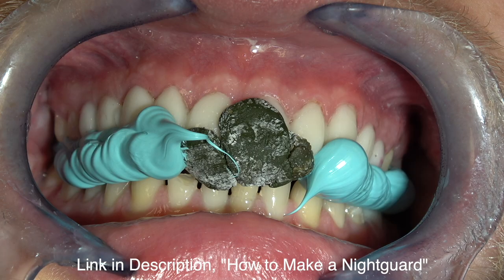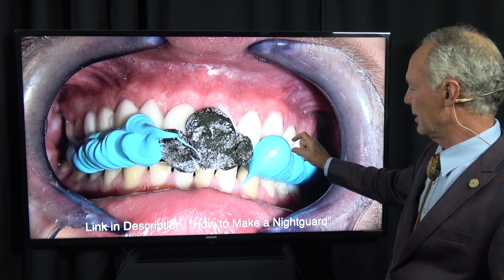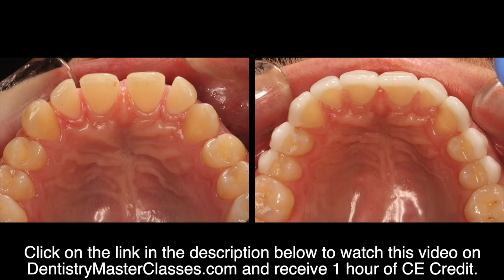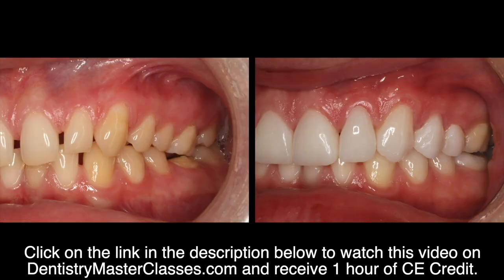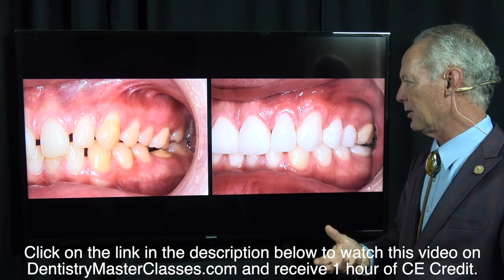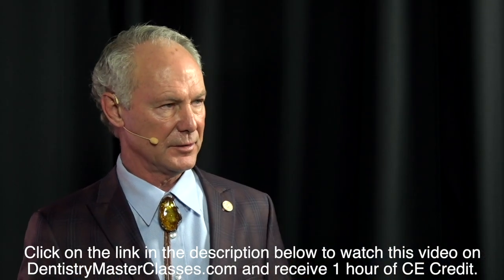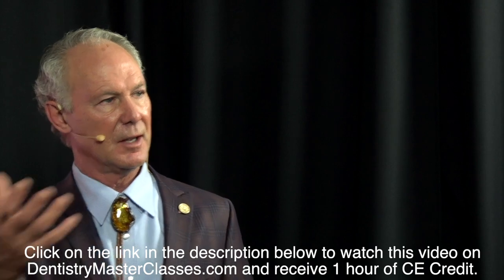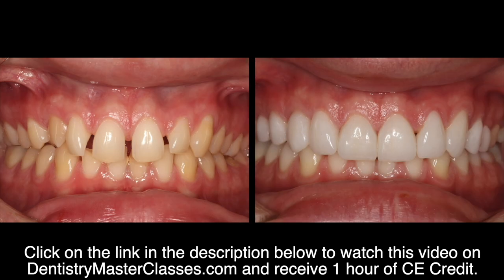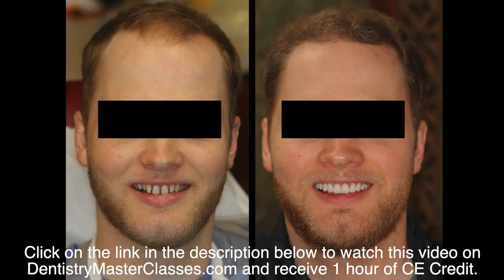Now I'm going to take an occlusal registration record for a night guard with the patient's bite open 2 millimeters between the second molar teeth. We're going to fabricate the shell for the night guard before the patient comes back, and then we'll reline the night guard when we seat the final veneers. I like fabricating night guards in my office so I can fabricate the shell and reline them when we seat the permanent restorations, so I don't have to take an impression, send it to a lab, and wait for it to come back. So these are the final restorations. This is where we're going.